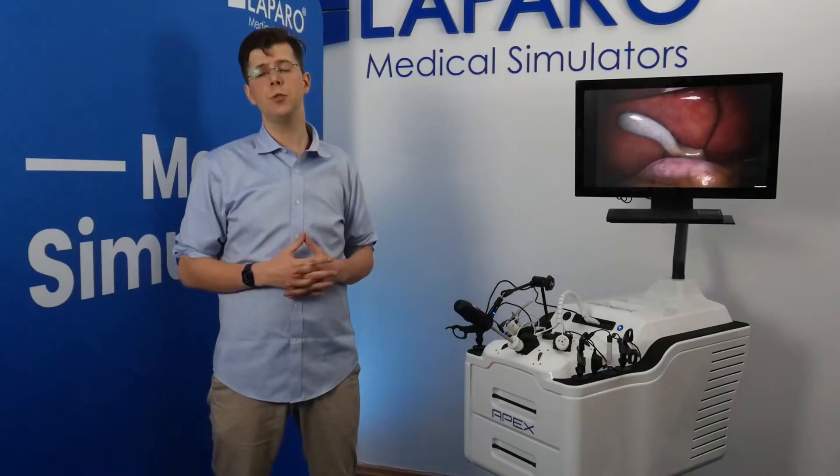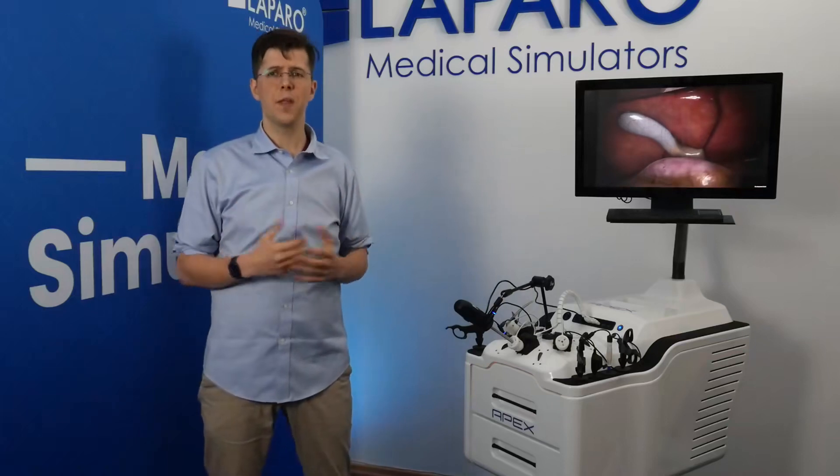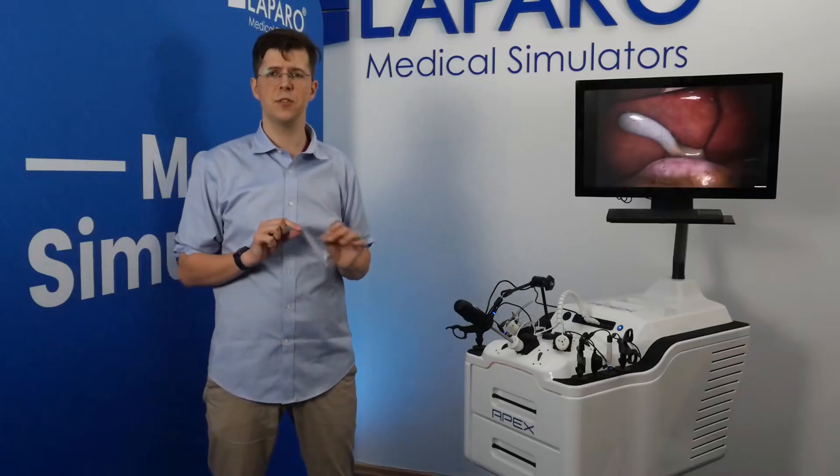This approach has revolutionized surgery because now patients can make a full recovery within days instead of weeks. However, the lack of direct visual access and the necessity to use these long and thin instruments has created a steep learning curve for surgeons.